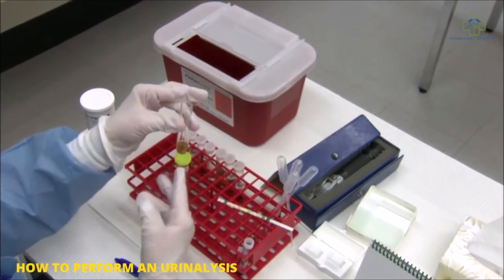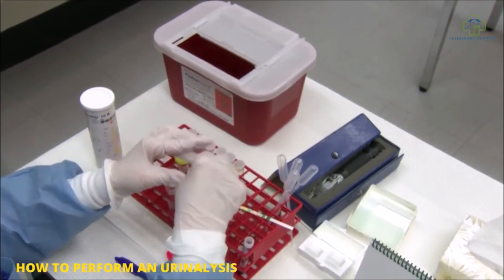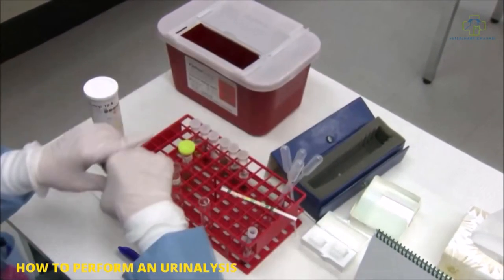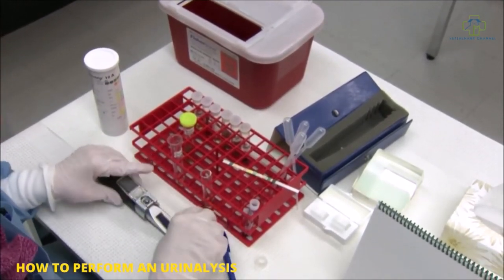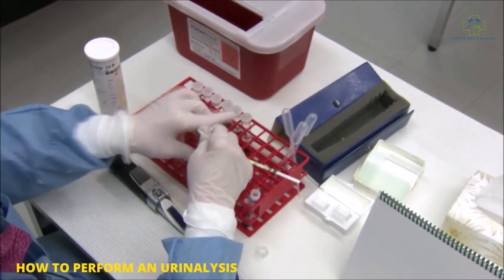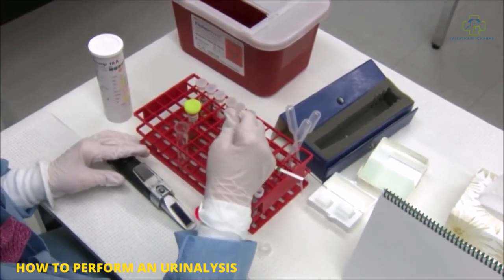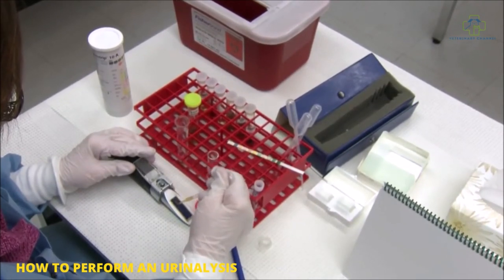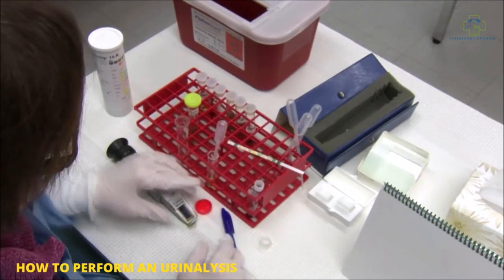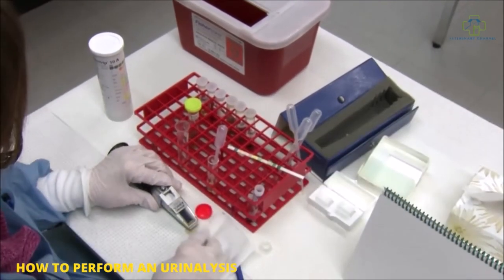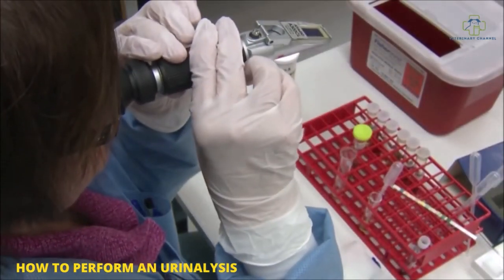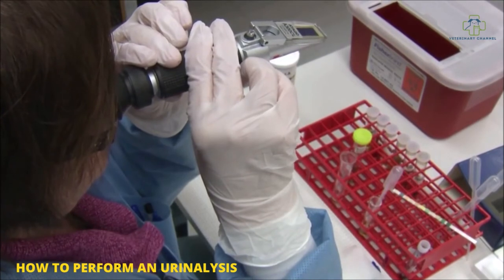The supernatant, the part that you've poured off, is what you want to use for your refractometer reading of the specific gravity. All refractometers are made slightly different, so you read the scale that is 1.0. You flood your urine onto the scale, make sure it covers the full length of the scale, and just look inside and get your specific gravity reading.